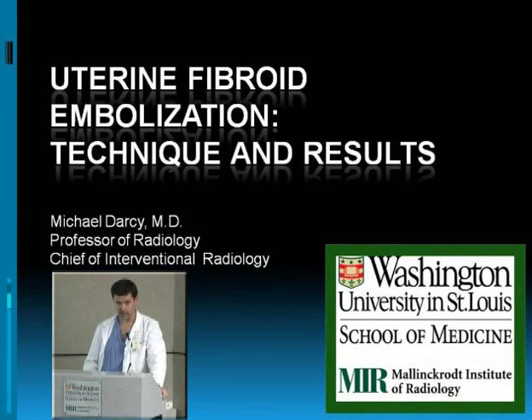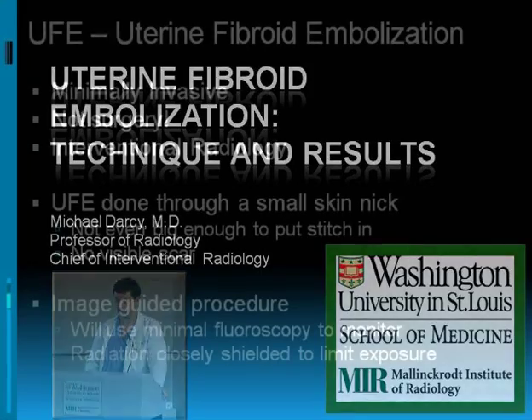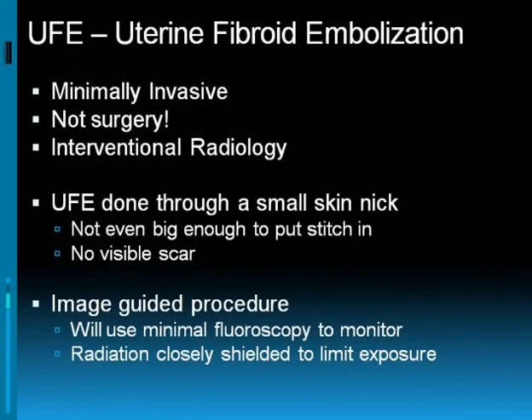And we'll be talking about uterine fibroid embolization, particularly the techniques and some of the results. First of all, what is uterine fibroid embolization? We typically refer to it as UFE, and this is a minimally invasive procedure. It's important to recognize that this is not surgery.